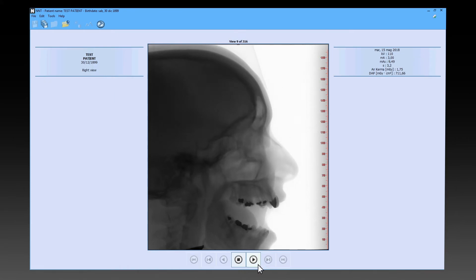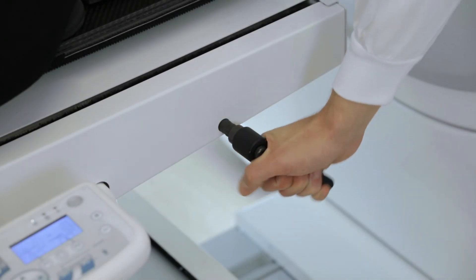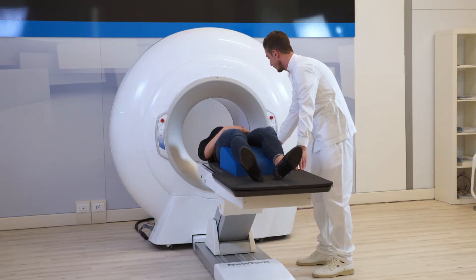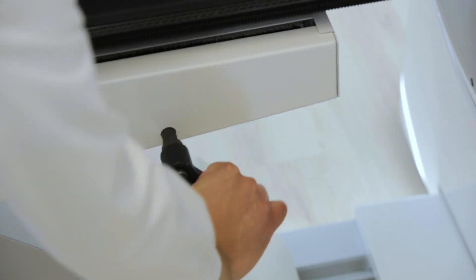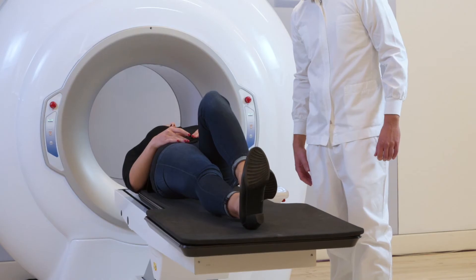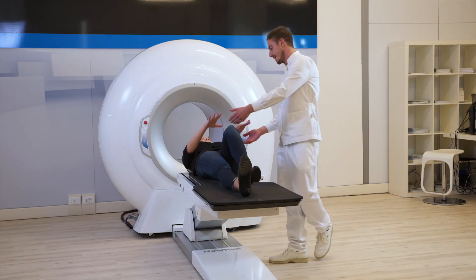At the end of the described procedures, the file is automatically stored and it is possible to check the scan using the special buttons. At the end of the scan, unlock the gurney and remove the patient from the gantry, moving the gurney outwards and then locking it again. Then press the P2 key to move the patient back to the initial position and lead her out.